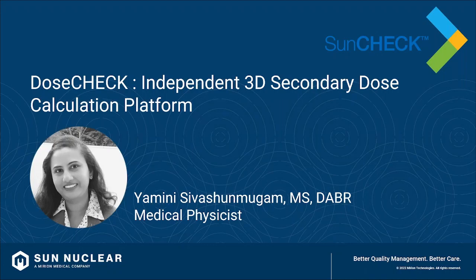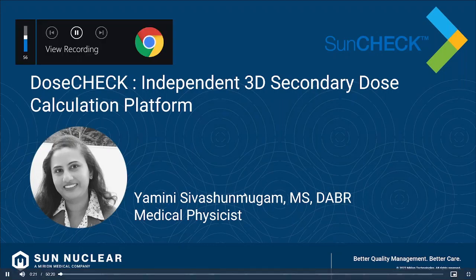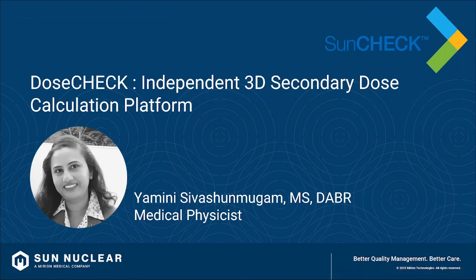Hello, everyone. Thank you for taking the time today to join us on this webinar, where I'll be talking to you about why verification of secondary dose calculation needs to go beyond traditional point-based MU verification. And we'll also be looking at how 3D secondary dose verification in DoseCHECK is essential to identify errors that traditional methods fail to detect.